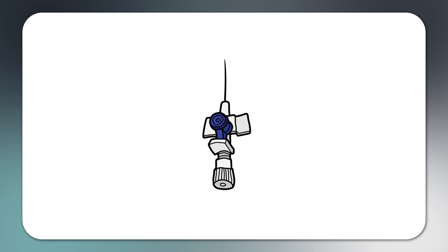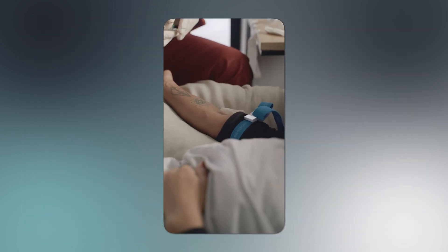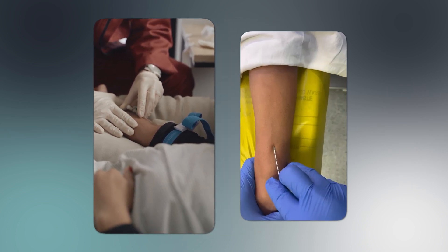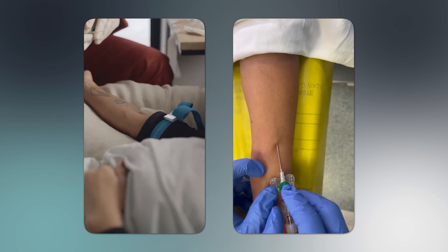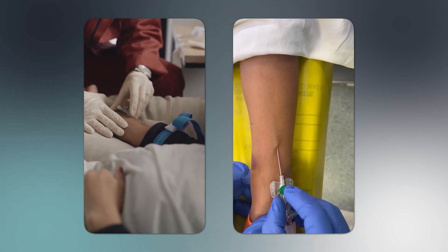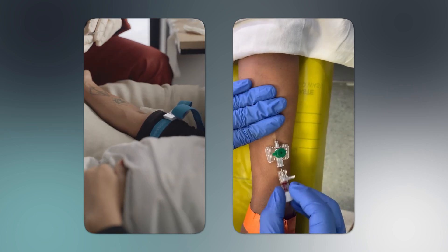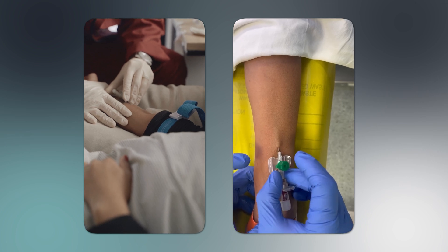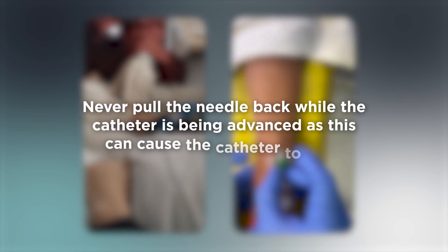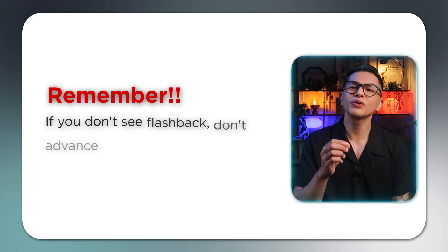Step 3: Insert the cannula. This is the critical moment that requires precision. Remove the protective cap from the cannula. Hold the cannula with the bevel facing up at a 15 to 30 degree angle. Use your non-dominant hand to anchor the vein by pulling the skin taut below the insertion site. Inform the patient they'll feel a sharp stick. Insert the needle through the skin and into the vein in one smooth motion. Look for a flashback — blood in the chamber — which confirms you are in the vein. Once you see flashback, lower the angle of the catheter almost parallel to the skin. Advance the entire unit slightly, about 2 mm, to ensure the catheter tip is in the vein. Then hold the needle steady and advance the plastic cannula forward into the vein. Never pull the needle back while the catheter is being advanced, as this can cause the catheter to shear. If you don't see flashback, don't advance the catheter — either redirect or withdraw and try again.